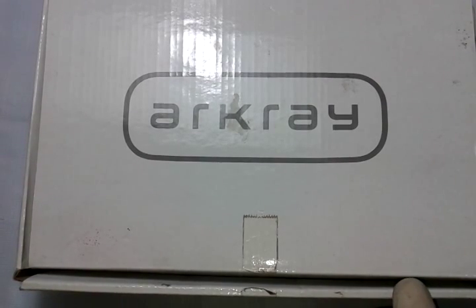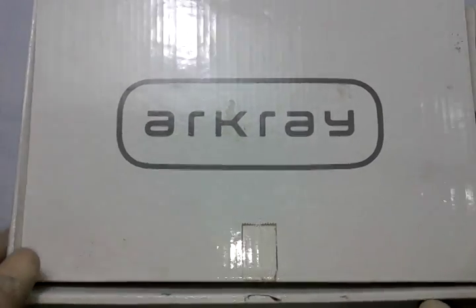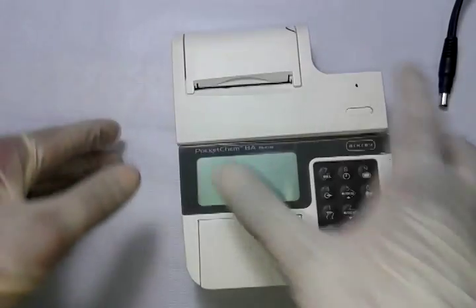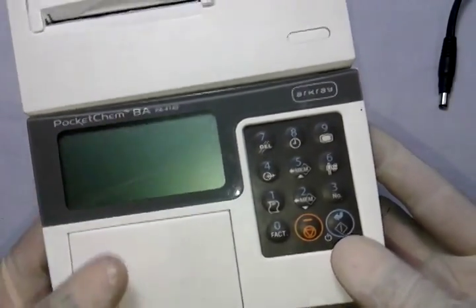Good morning friends. This is another video to perform a blood ammonia test with our latest instrument called Pocket Chem BA. I'm going to show you how to perform a blood ammonia test with this latest instrument from Arkray Japan.